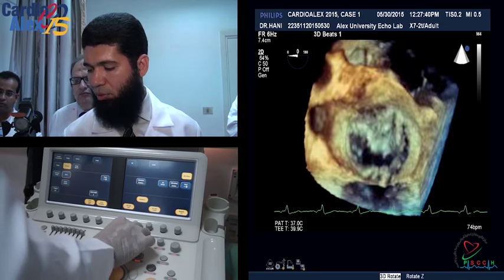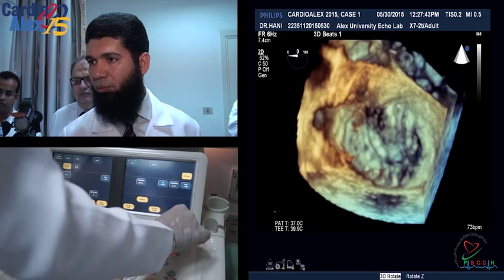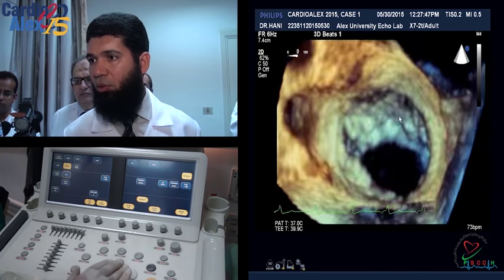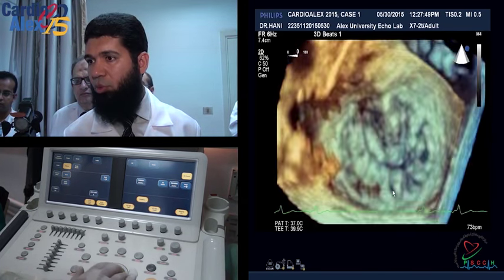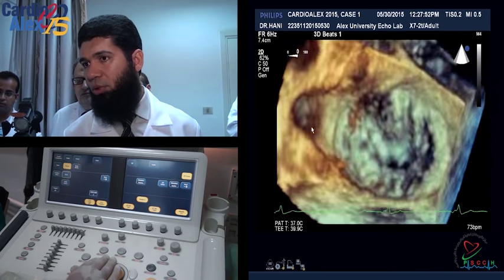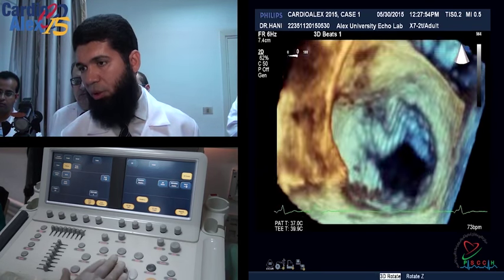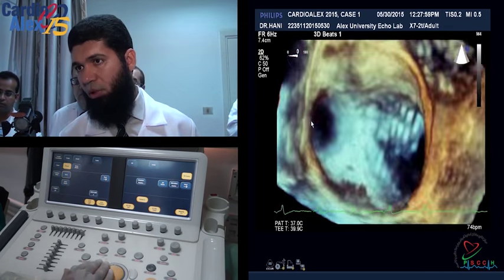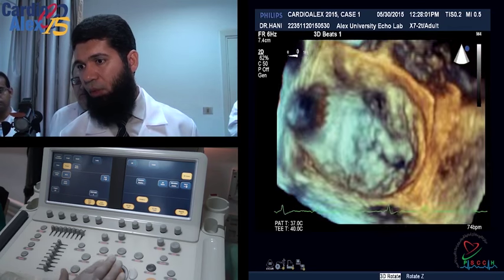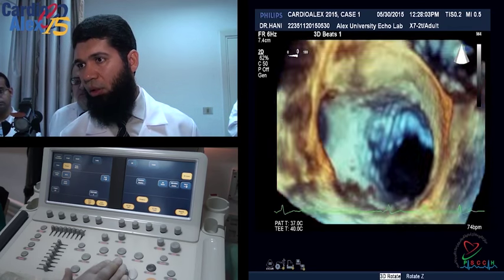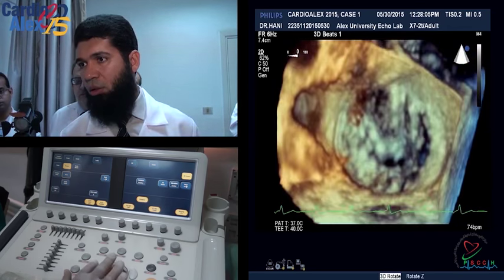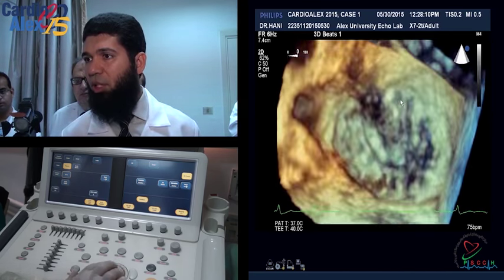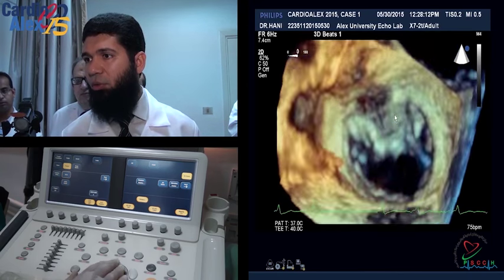This is the mitral valve. I can magnify from here. This is the anterior mitral leaflet, posterior mitral leaflet, and this is the left atrial appendage. By some tilting, you can see the left atrial appendage more clearly — this is the left atrial appendage ostium. As you can see, there is some bulge of the middle segment of the anterior mitral leaflet. This is A2.